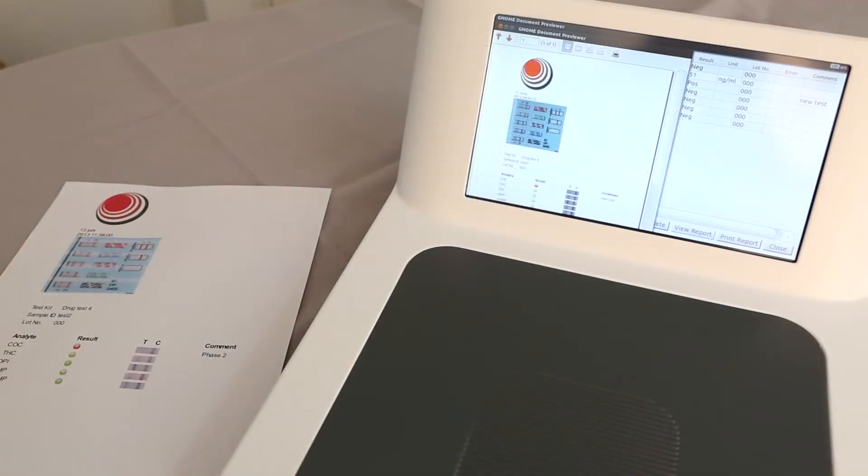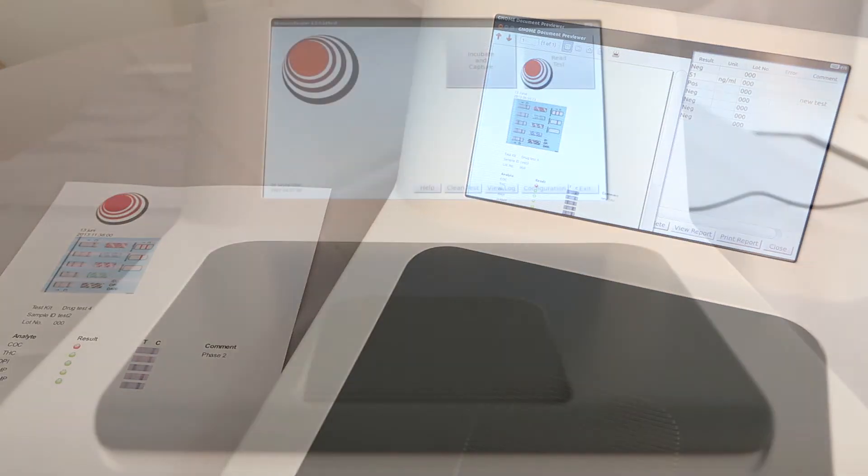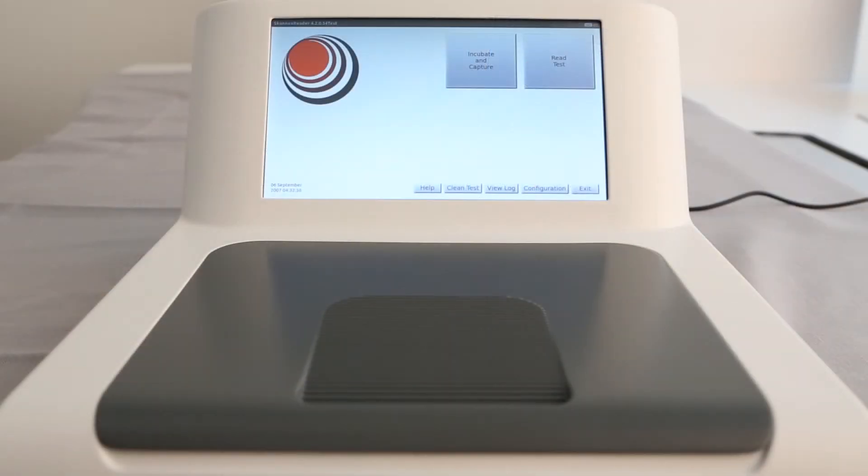With the ScanFlexi reader, rapid testing at point of care is reliable and easily achieved. Time matters.